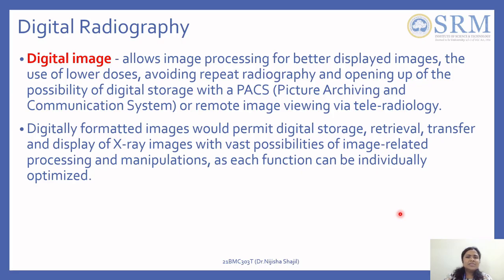Now to the last section of this unit, which is digital radiography. What do you mean by digital radiography? Whatever you're talking about, you're going to digitize it and see it on a computer. So this allows image processing for better displayed images. What you can do is use a lower dosage and improve the image with the help of image processing algorithms. So this becomes an easier and more efficient way of diagnosis.